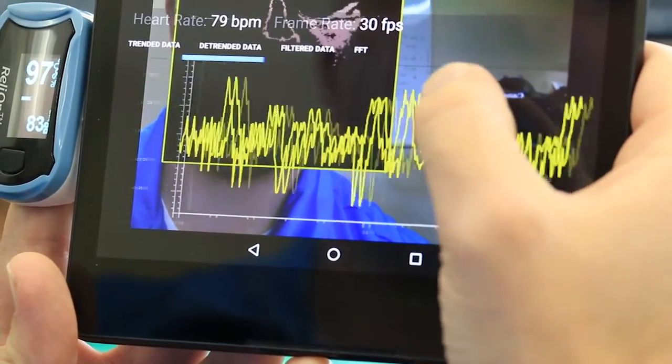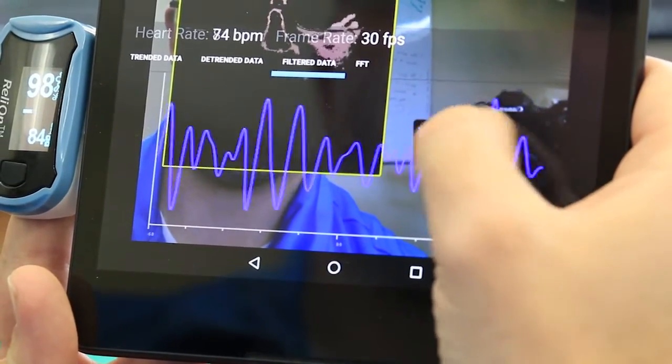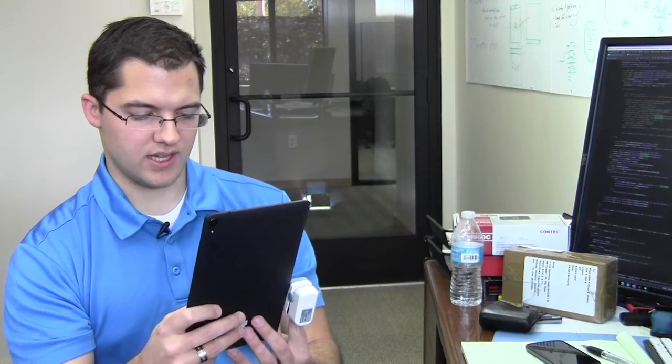I've only demonstrated two of the algorithms which we've already coded up in this Android app that we use. There's going to be more to come. That's probably all I have to show you today.